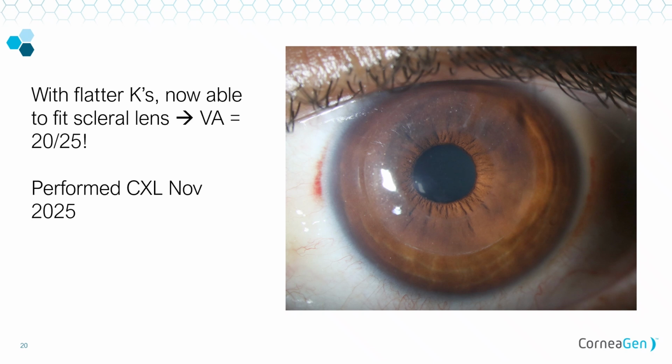So he did wonderful. I did send him back to the scleral contact lens optometrist. She was able to fit him, no problem. 20/25. He doesn't even wear them all day. He wears them when he needs to, and he accepts his 20/60 when he doesn't. That's a super advanced case. I just show it, not because that should be your first case, but so that you can see the power of the procedure. A much more straightforward case, I would say, would be somebody like, I'm going to skip this one.